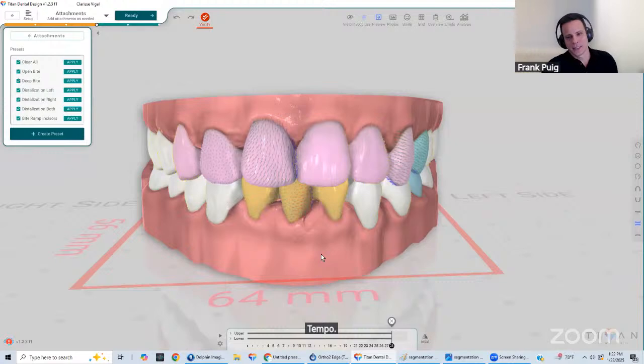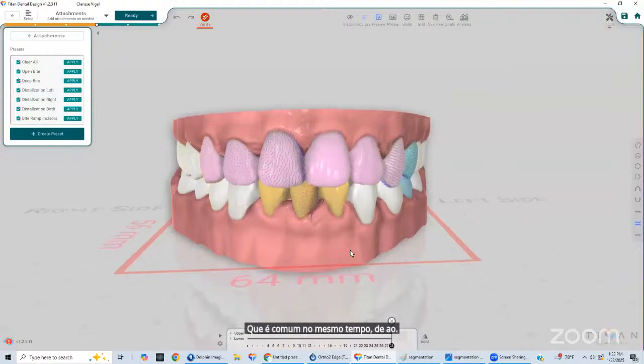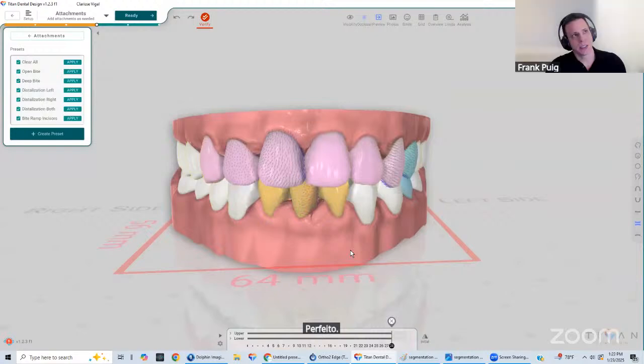Awesome. Thank you. Yeah, thanks. I'm really glad that you brought that up. We have a segmentation of the CBCTs that is coming very soon. Most likely that will land around the same time as AAO. But we do have another thing that is going to help even more doctors, because CBCTs have all the information. The problem is that a lot of doctors don't do CBCTs for every single patient because of the radiation and all that.